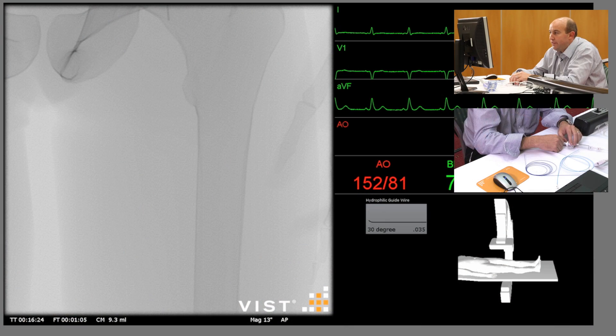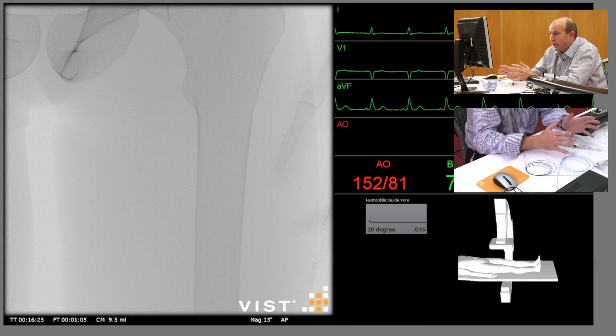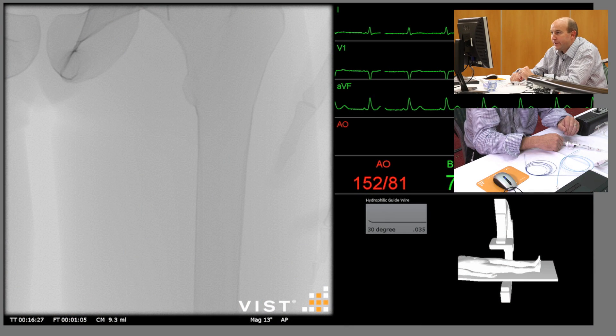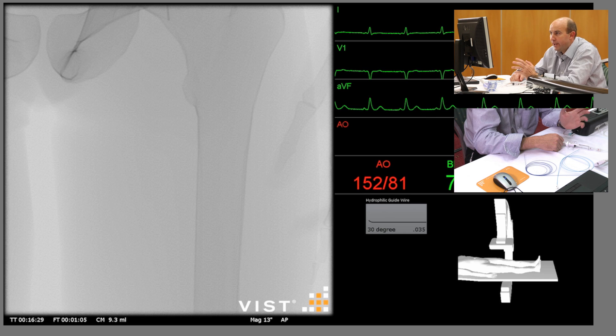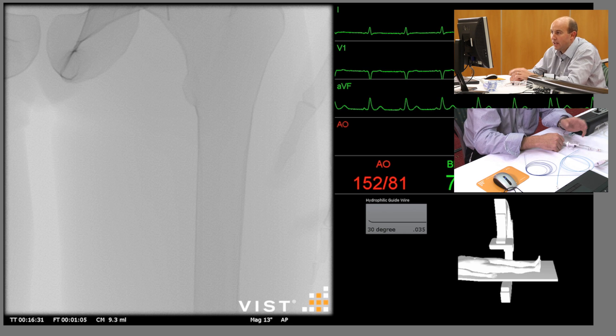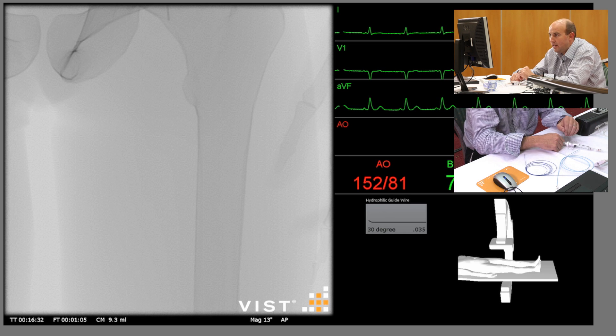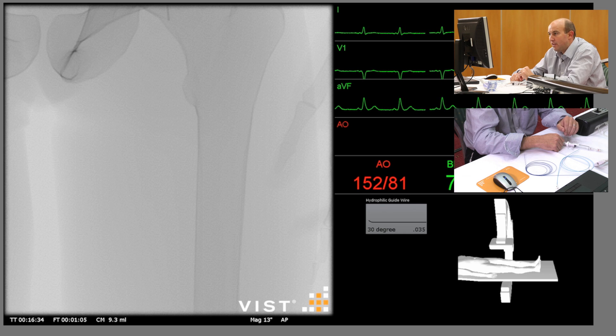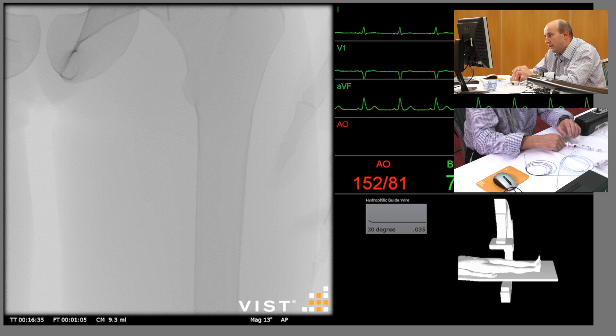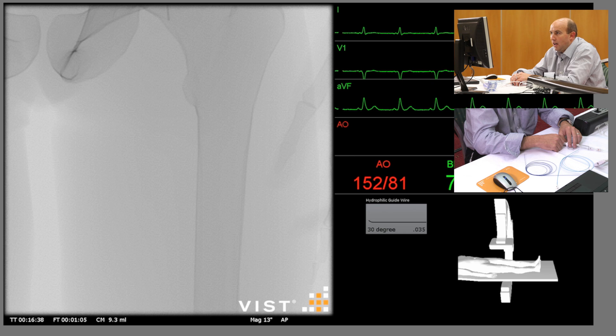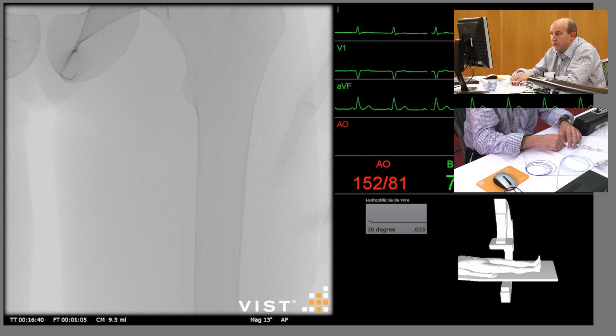This is a 55-year-old claudicant who has had some pre-operative imaging already, so the diagnostic angiogram shows an isolated SFA mid SFA lesion which you can see on the left-hand screen, and what we're proposing to do today is use the simulator to show you the steps of the procedure for an SFA angioplasty.